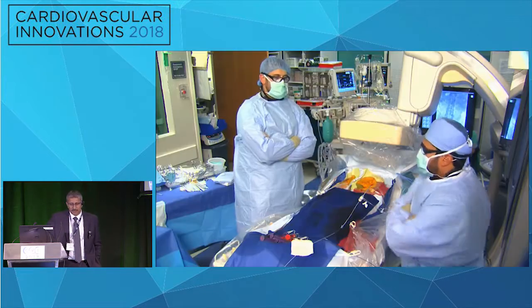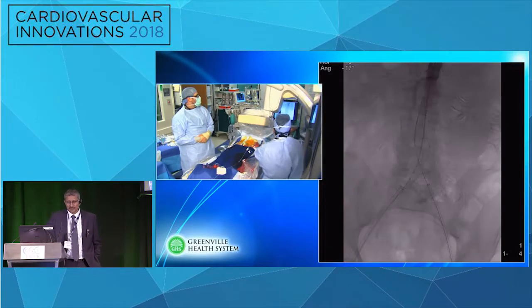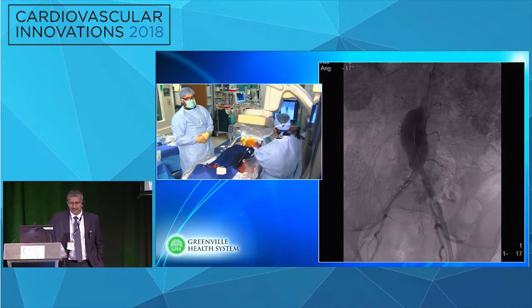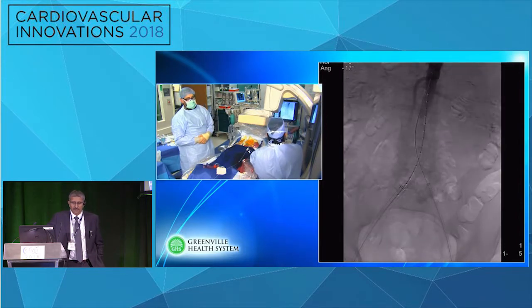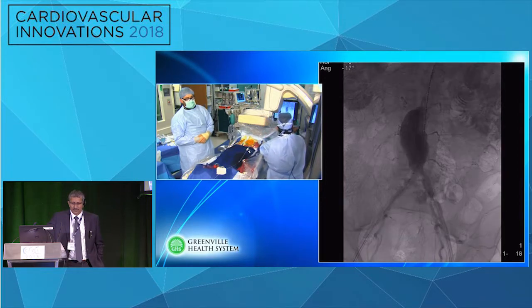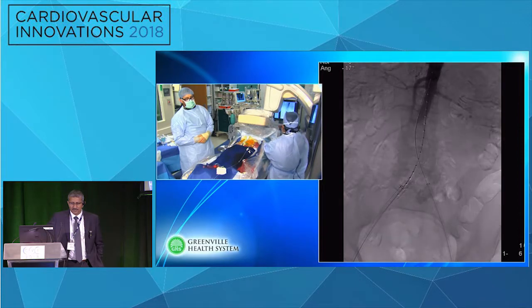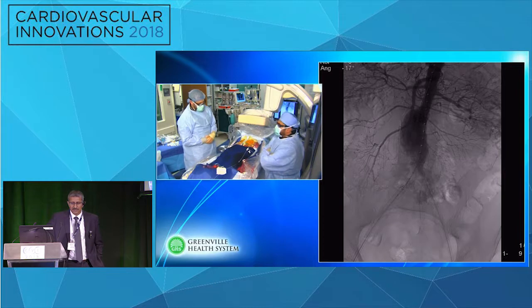So if we can show the aortogram. Can you play back the aortogram, please? As you see here, we've got the catheter. We've already got our 16 French in from the right groin and our 12 French in from the left, the 16 French to deliver the device. You can see our lowest renal is at L2 about. We've actually got that marked, and we've cannulated the renal so we can know exactly where to place the main body. Next thing we're going to do is plan to IVUS.